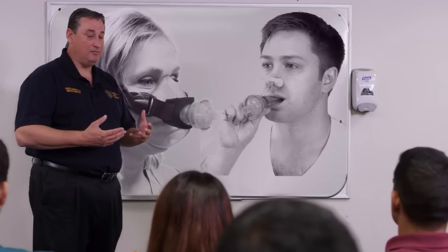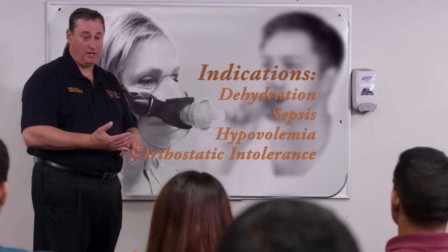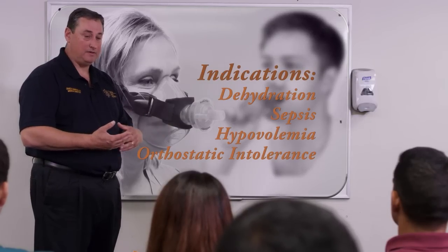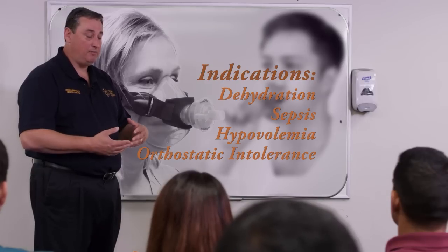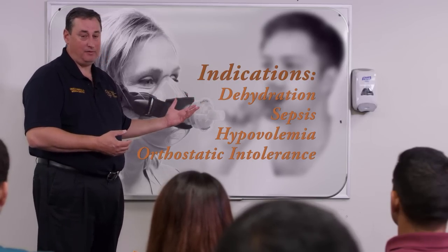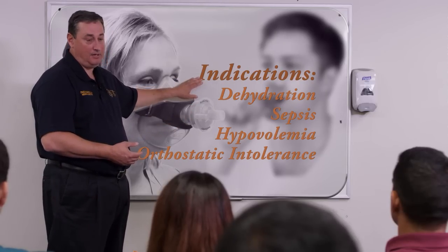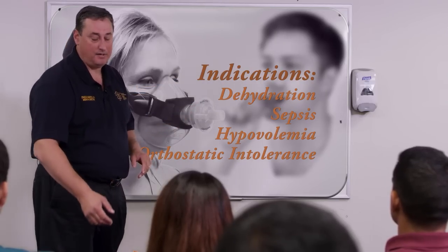We're looking at patients who may have hypotension from internal or external hemorrhage and hypovolemia with a blood pressure of less than 90 millimeters of mercury. A patient may also have an issue with dehydration, perhaps anaphylaxis, or even sepsis. Those would be the appropriate types of patients that would be indicated for the application of this device.